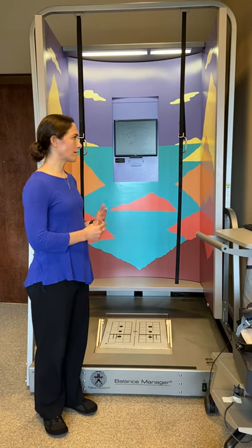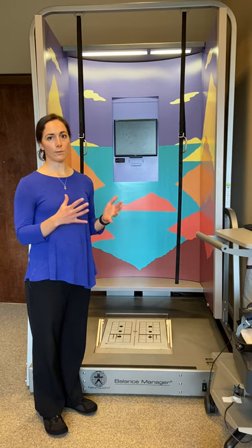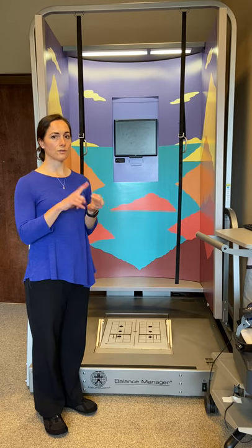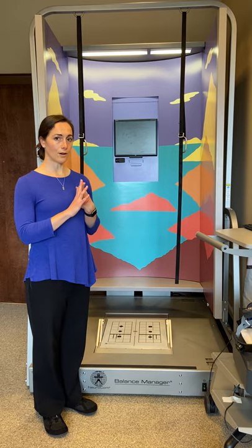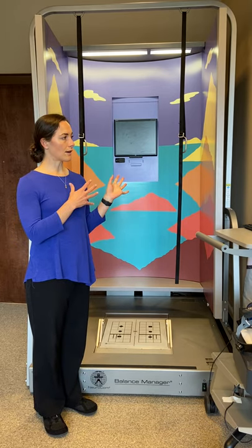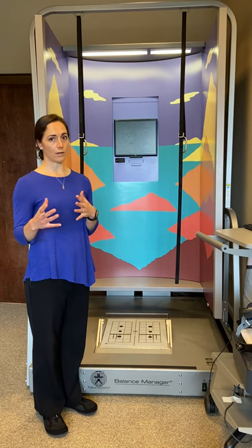This is the computerized dynamic posturography machine used to assess the function of your balance systems — your inner ears, your eyes, and the feeling in your feet and legs for balance. Those are the three we all use. This test helps us to determine which areas are not functioning well and which areas might need improvement.